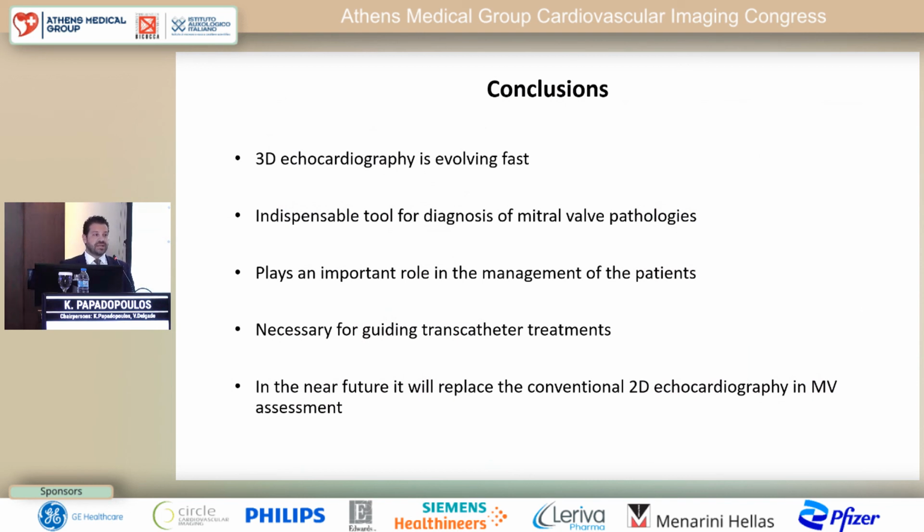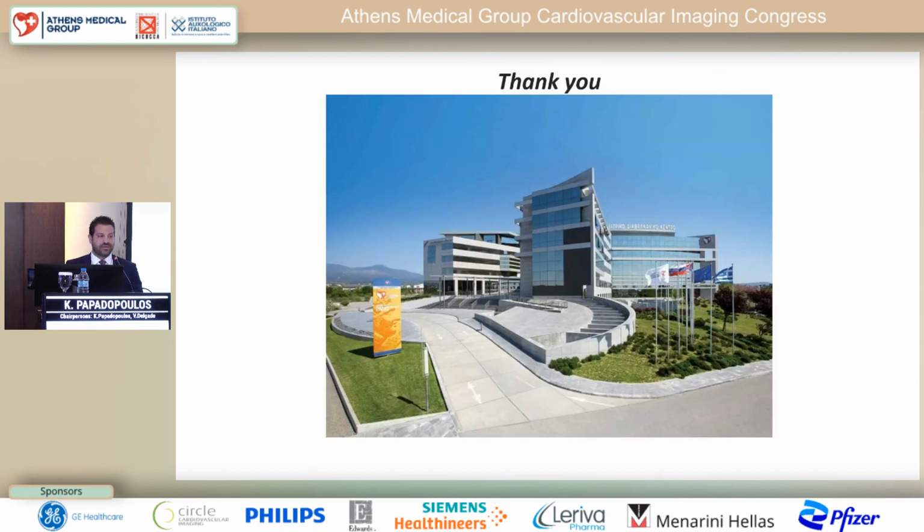It is indispensable for diagnosis and management of our patient, and it is necessary for guiding transcatheter treatments. In my opinion, in the near future, 3D echo will replace totally 2D in the assessment of mitral valve. Thank you for your attention.